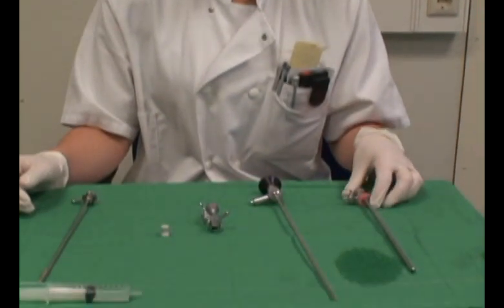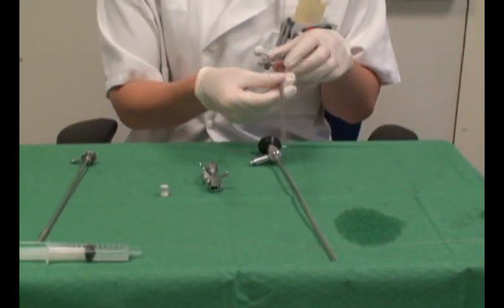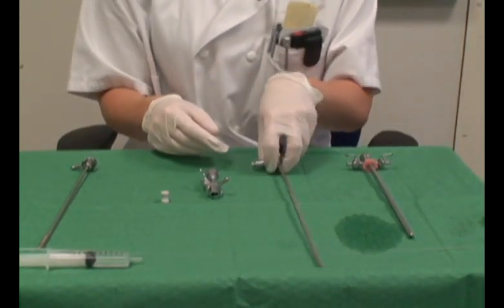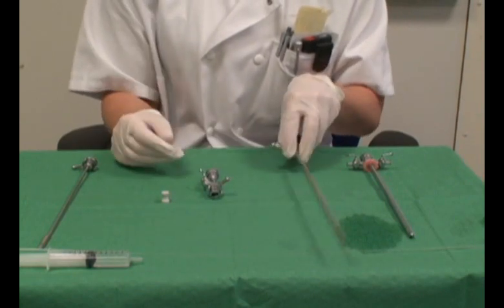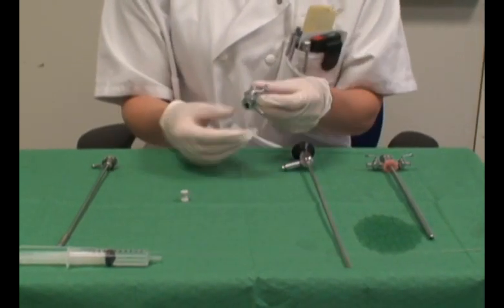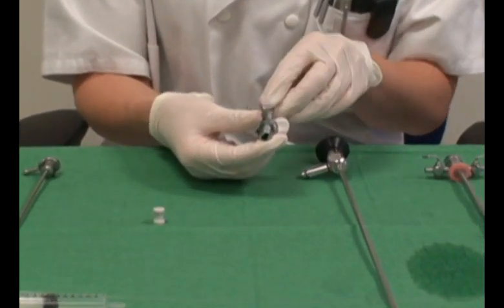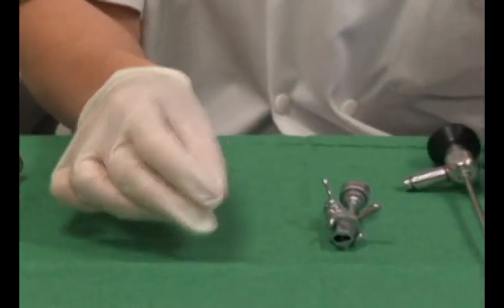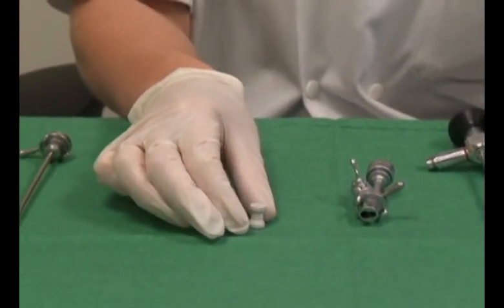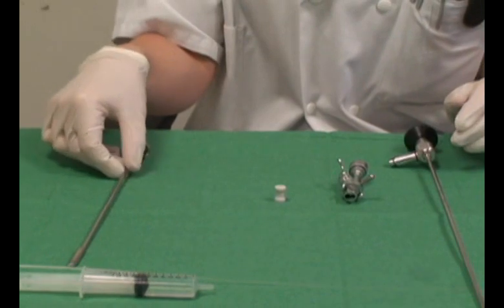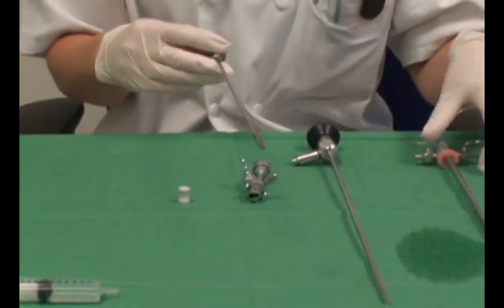The different elements of the cystoscope are the sheath, the lens, the working element, and an adapter used to maintain water tightness. The use of an obturator is optional.